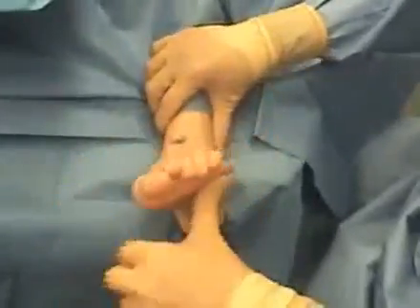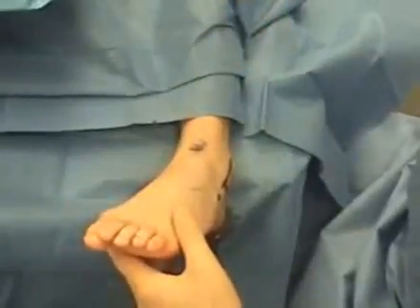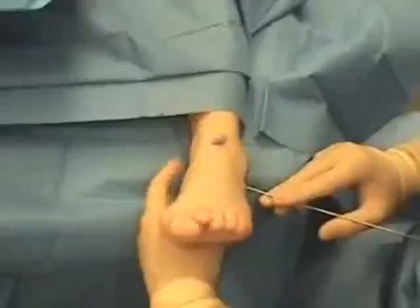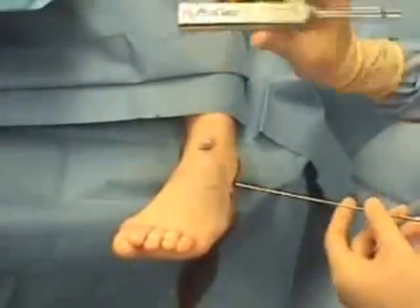So again, we see because of that forefoot valgus, the ground just keeps pushing up on her first ray, and there's our bunion deformity. So I do these prophylactic for patients with these bunions. I do this procedure, and we actually see a decrease in the IM angle. So we might not even have to do a bunion surgery on her.